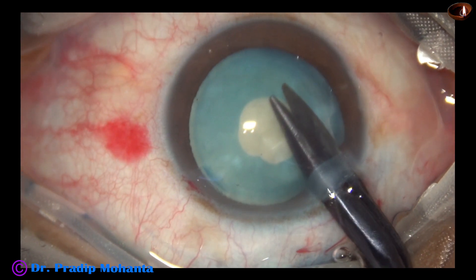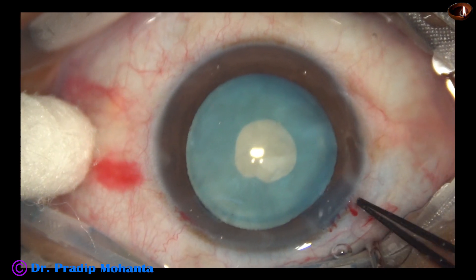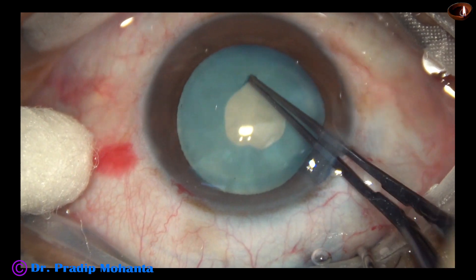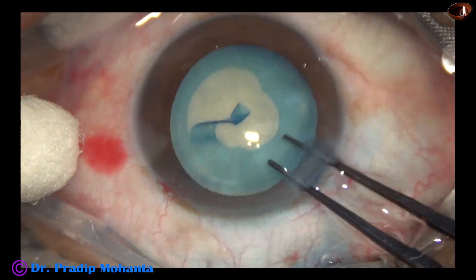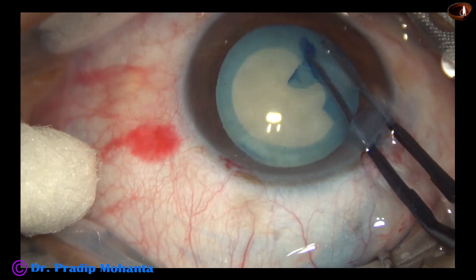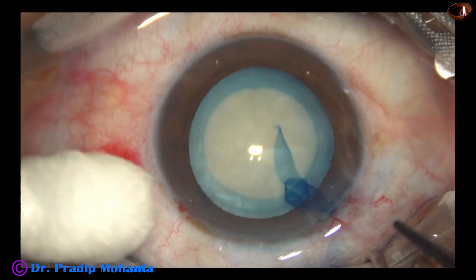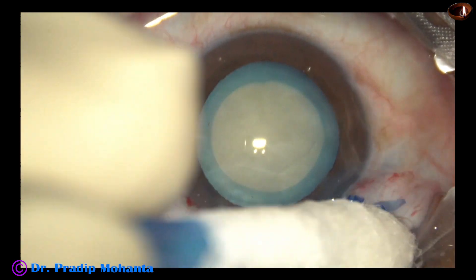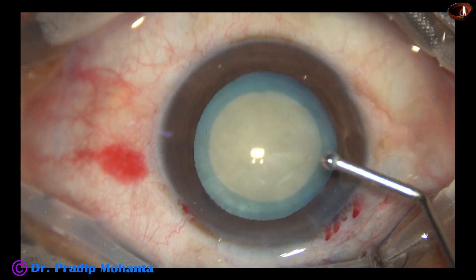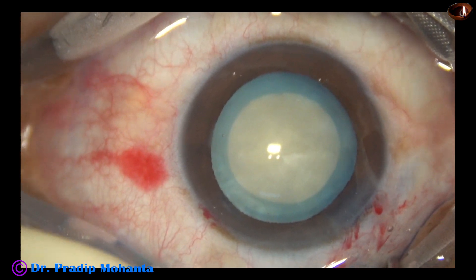A nick is made at the margin of the mini-rhexis with a Vannas scissor. The Utrata forceps is used again to enlarge this mini-rhexis into an optimum sized rhexis of about 5.25 millimeters. When the intralenticular pressure is reduced by aspirating some lens matter, there is no tendency of the capsule to run to the periphery, and we can easily do a rhexis of optimum size.